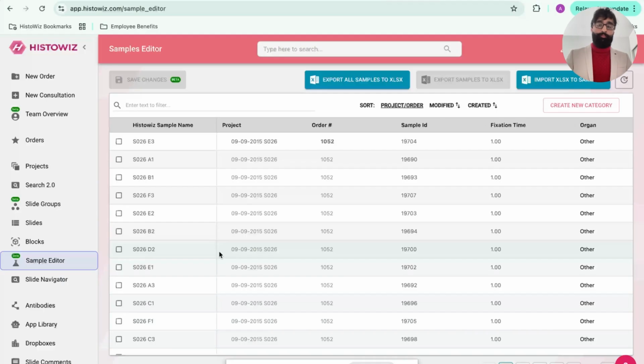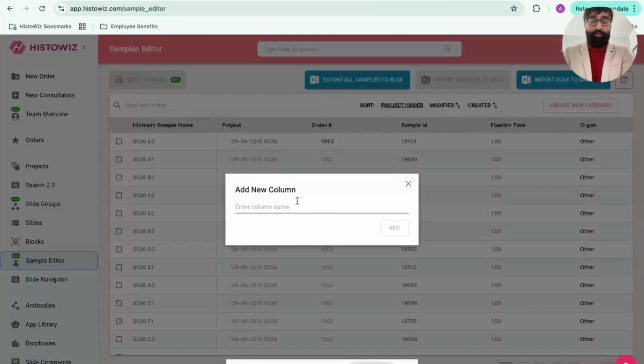Now, there are some pre-populated fields that you might have entered, but say as your research evolves, you want to create new fields. You can easily do that by creating a new category. Say, for example, I'm interested in bile duct, and percentage bile duct itself would be a metadata field.